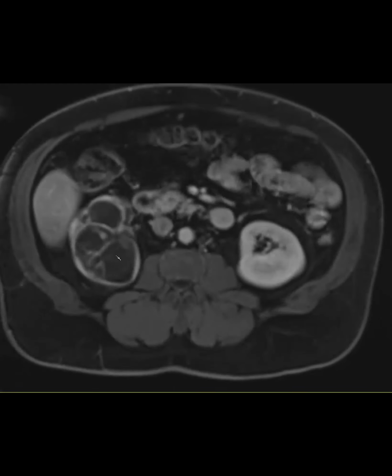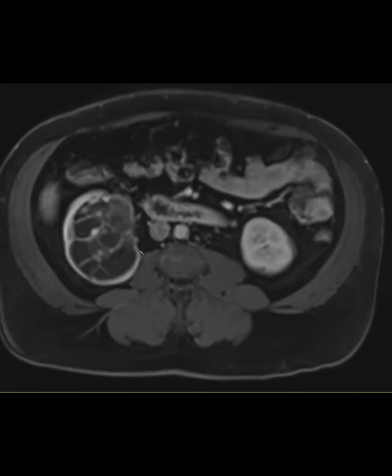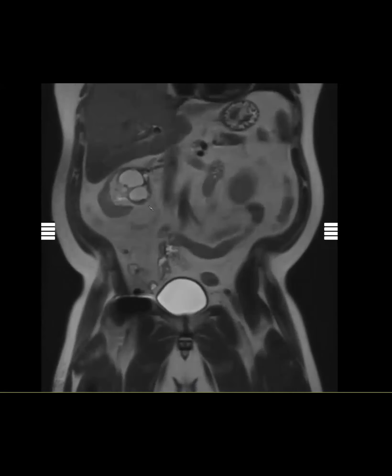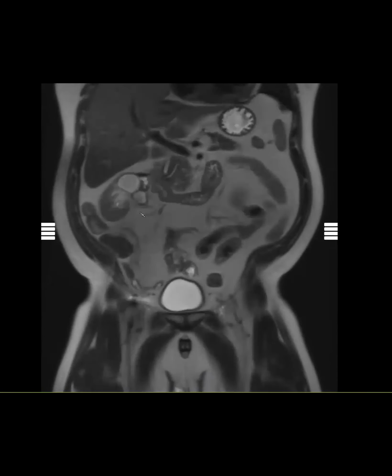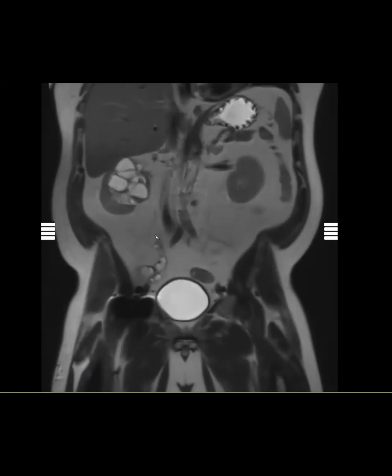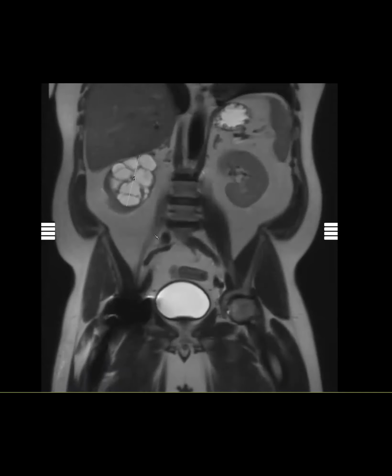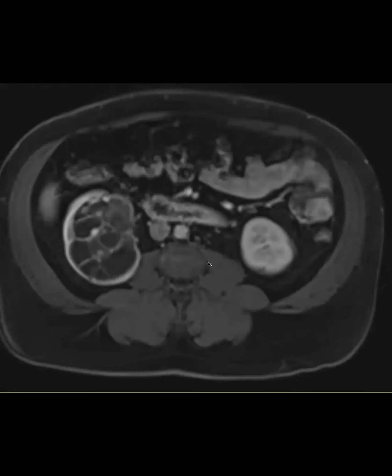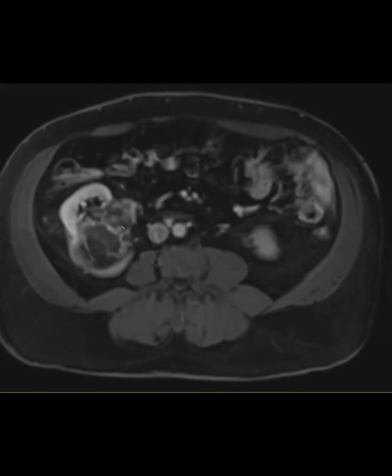Yeah. So that's exactly it. We said it could be a multilocular cystic nephroma of a duplicated collecting system, because we were seeing that part and then a separate collecting system here. Almost looks like a bifid sinus. But we said there's too much nodular thickened enhancement. And actually down here, there are even real nodules.